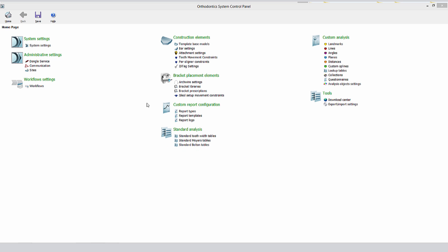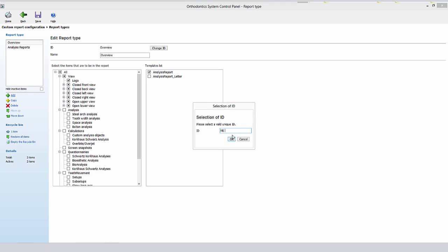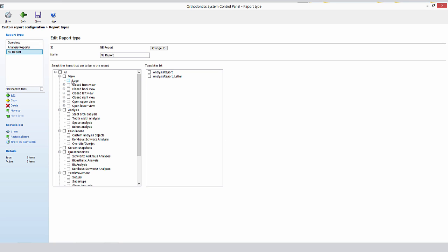Communication is always key in any kind of analysis, and this software allows you to customize your report. You select or choose a new name for your report, and select from screenshots, calculations, teeth movements you wish to communicate, and of course, very important, the areas where the IPR — Interproximal Reduction — was performed.